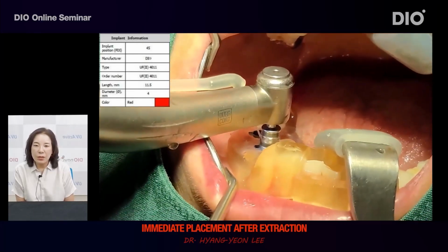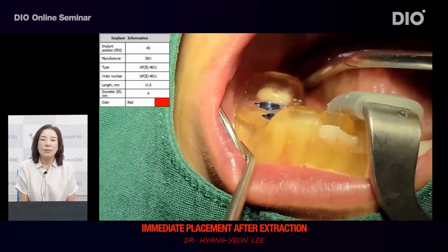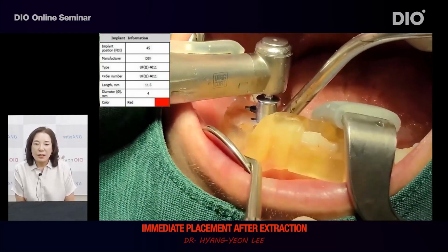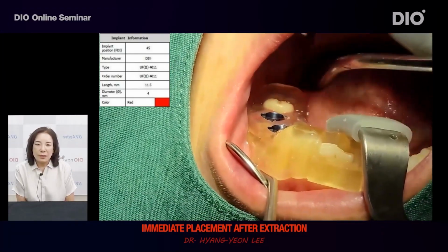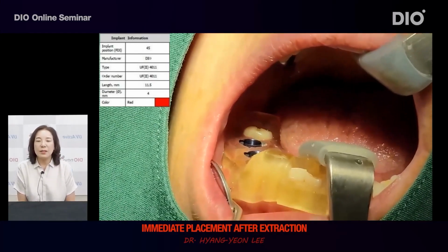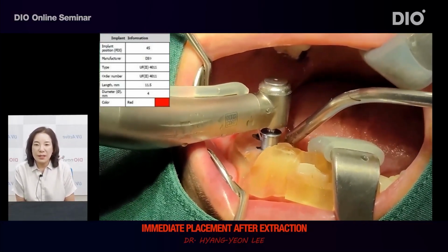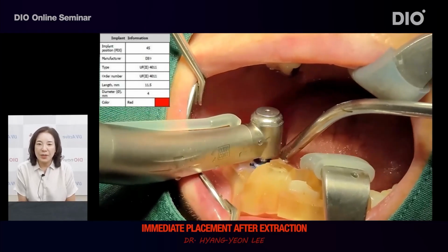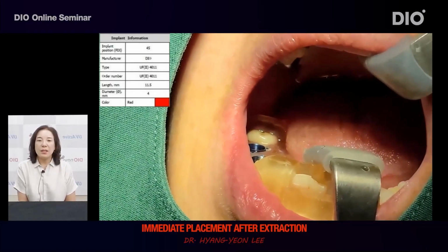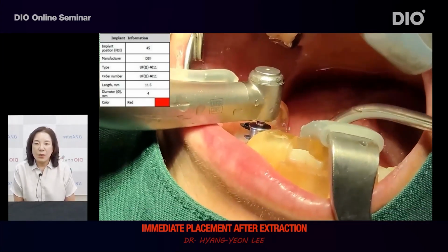Execute bone flattening drill to the bottom line since the offset is 9.0 millimeters. In the case of simple guide implant surgery like this, you can use the 2.0 by 5 drill that makes contact with the sleeve without having to use the drill tube. Even if you use this, it is possible to place implants accurately if you keep the direction correct. It is the 2.0 by 5 drill for which the drill can come in contact with the sleeve. This is the 2.7 by 5 drill.